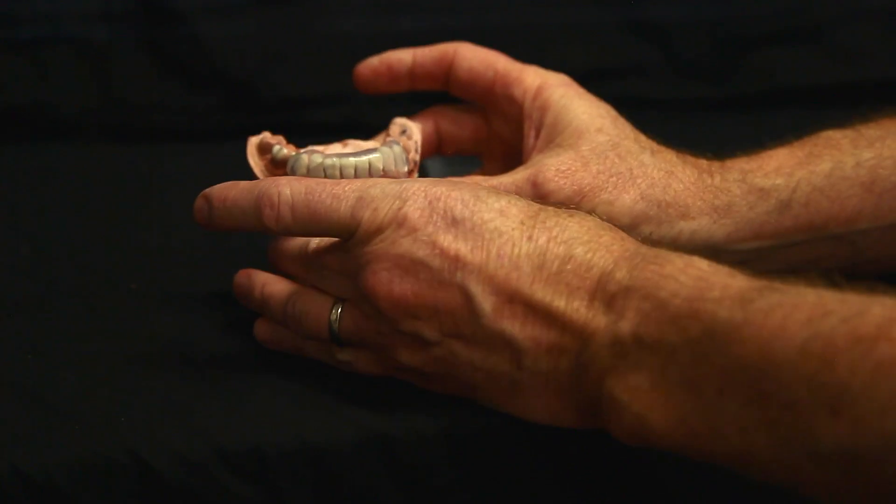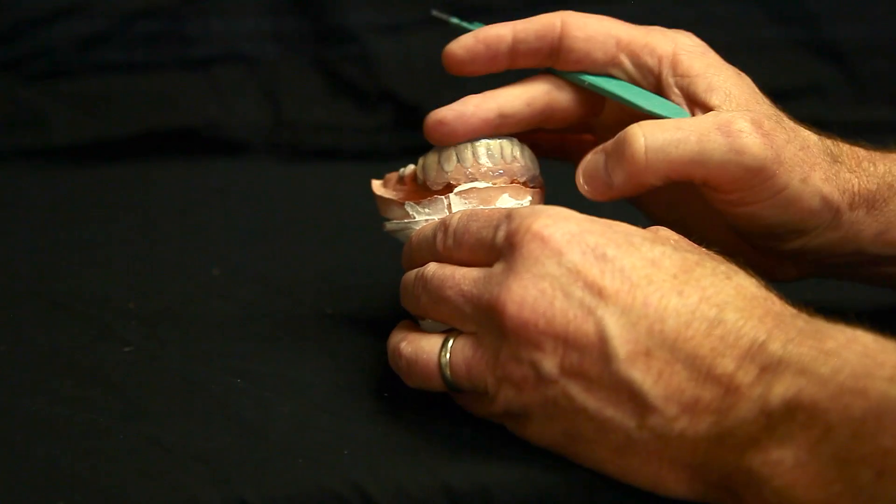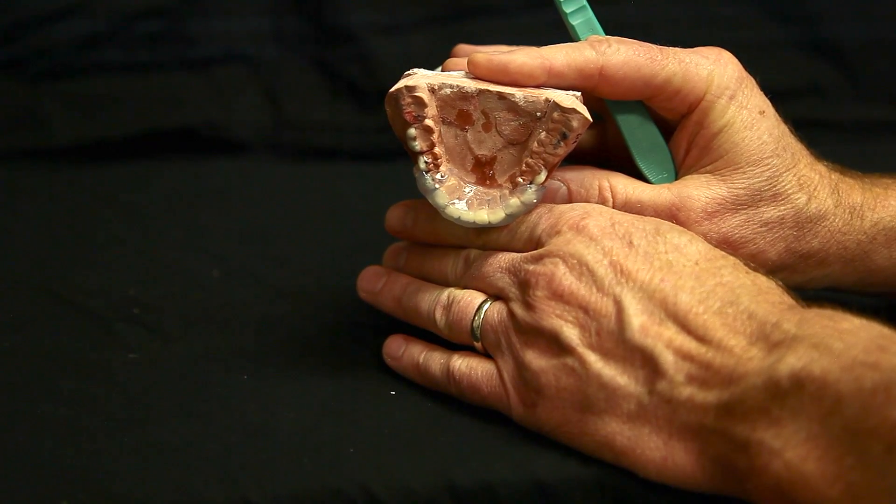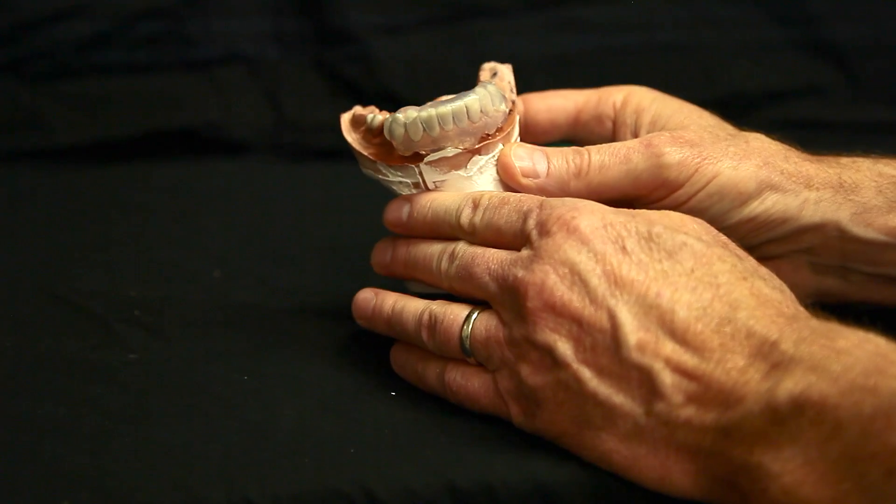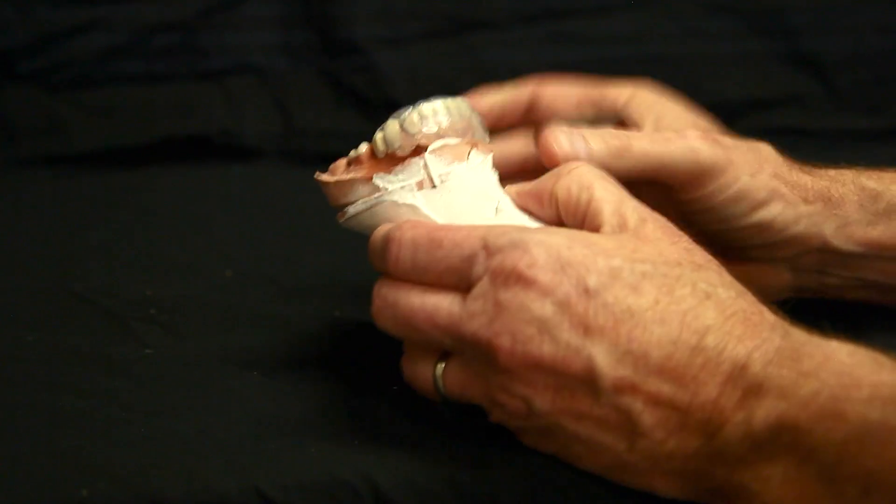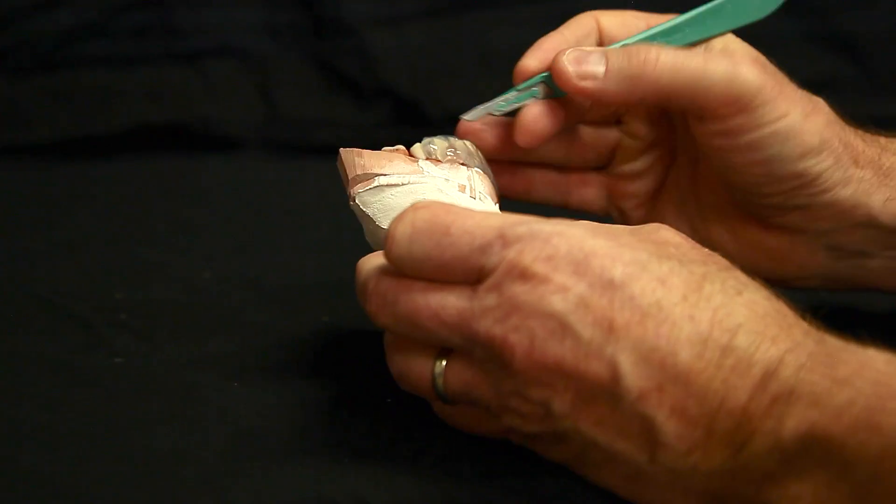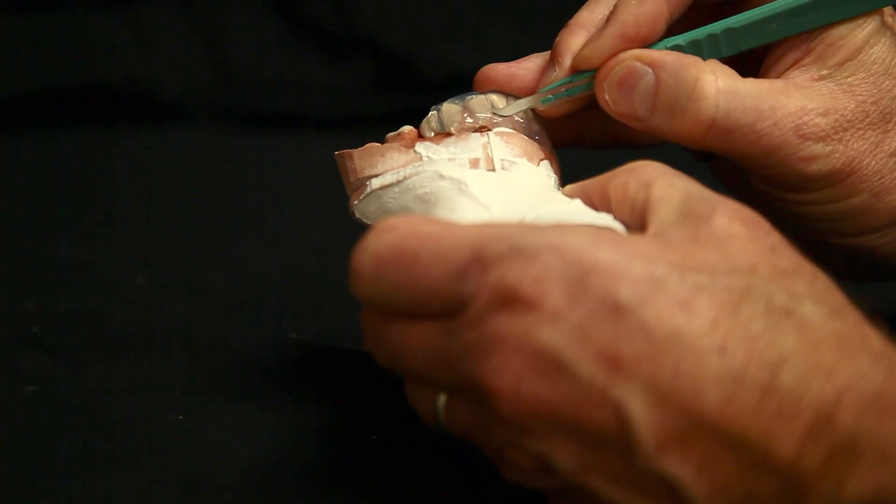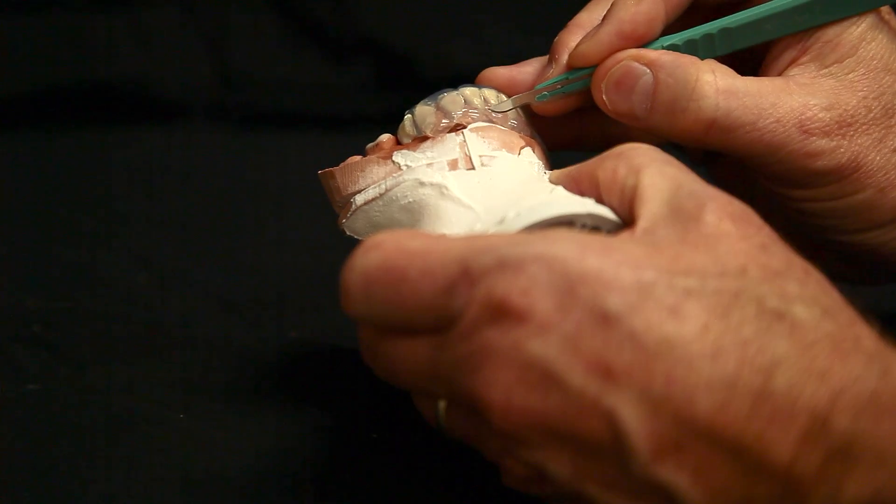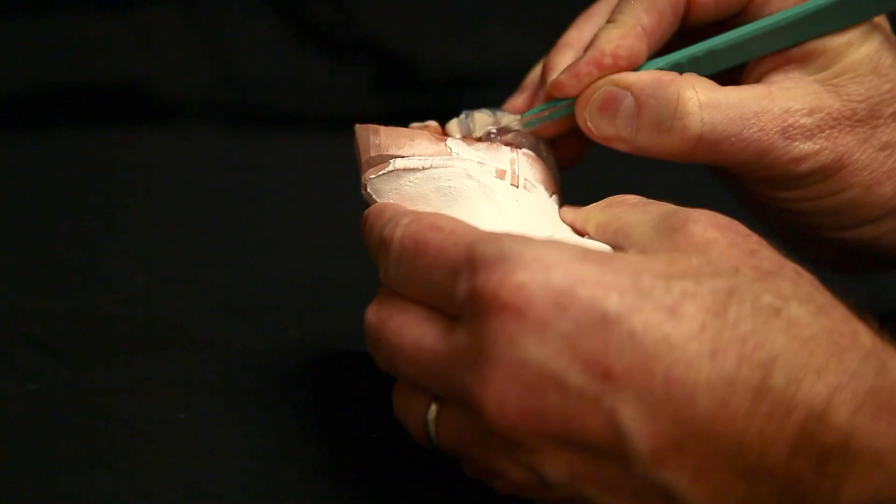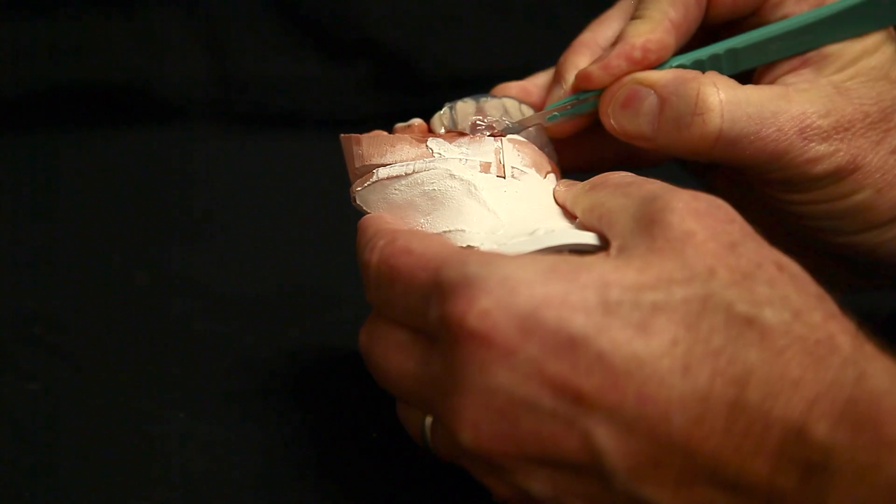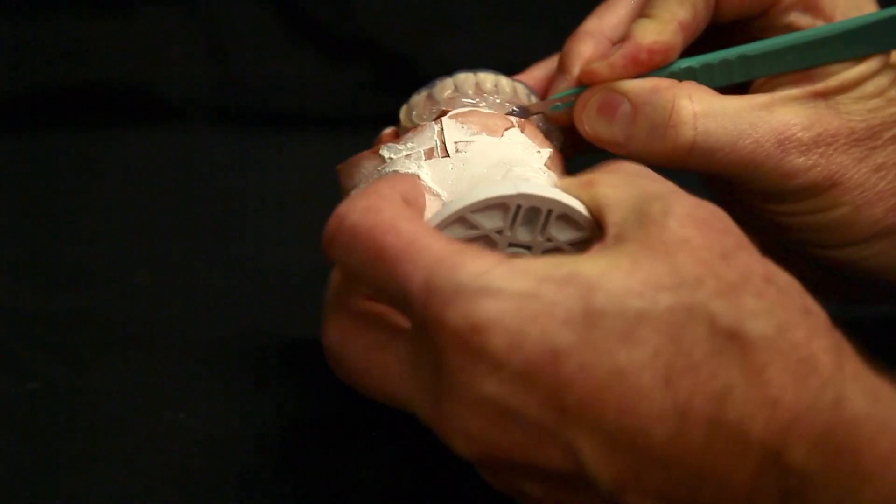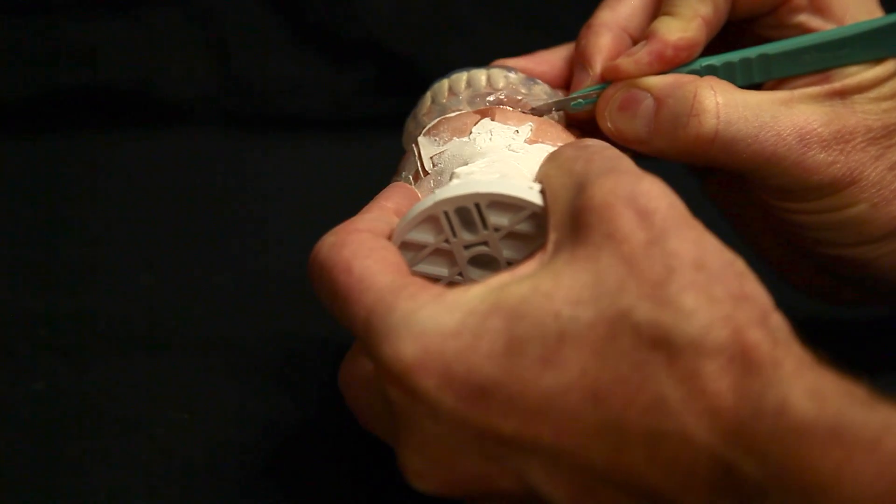This material sets fairly fast, so you need to kind of work fast. That's about it. Let's let that set. Okay, so the material is completely set and we got on the linguals nice and smooth and you can see it's a pretty consistent thickness all the way through. All you're going to do is just take a number 15 or whatever blade you're comfortable with and you want to cut it just below the edge of the wax-up.